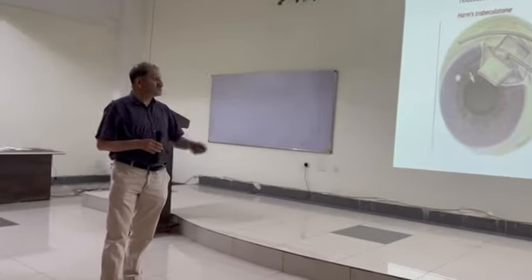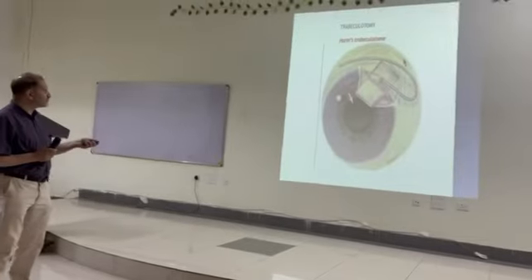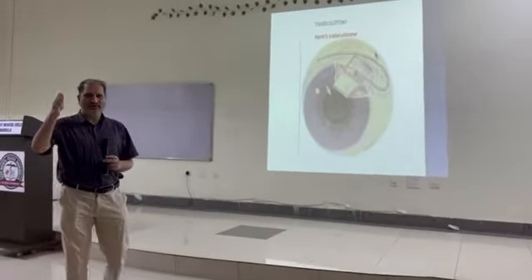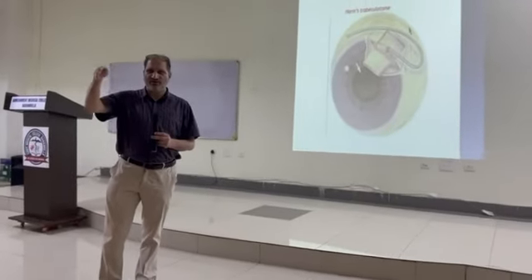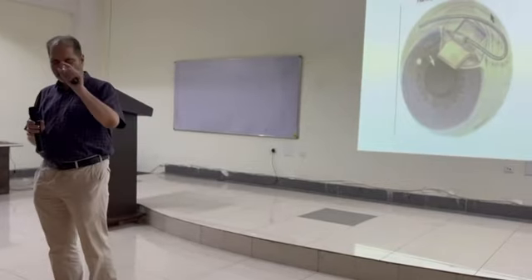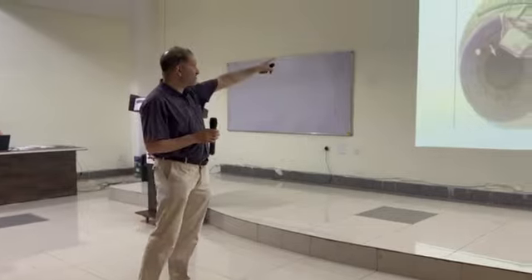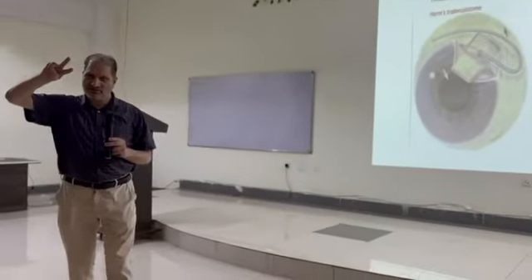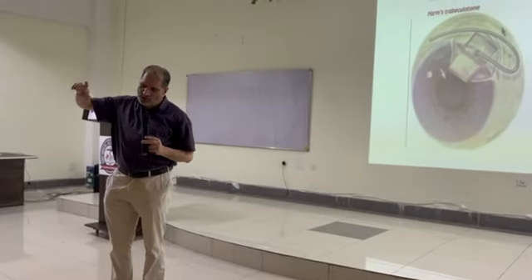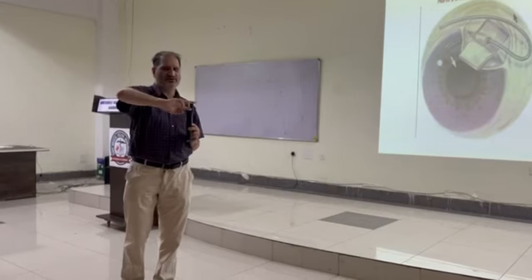Next. So this is a trabeculotome. Here we go to the limbus, make an incision, and deepen it until we see Schlemm's canal. Then we hook it with this. There are two limbs in this, called the trabeculotome. One limb we put in Schlemm's canal, the other limb is outside the eye. Then we rotate it like this.